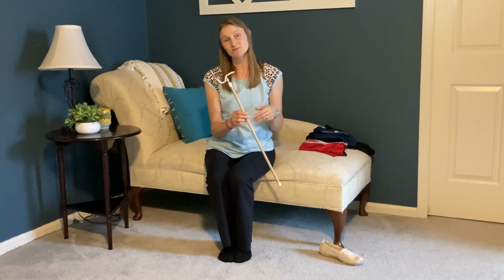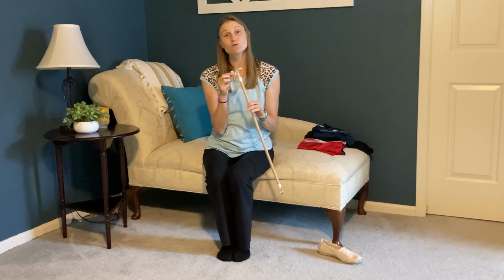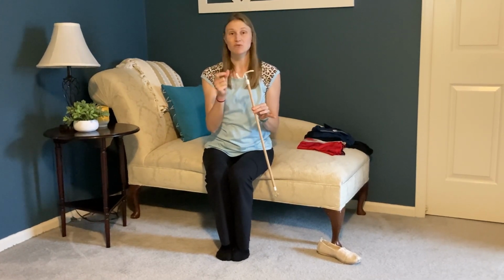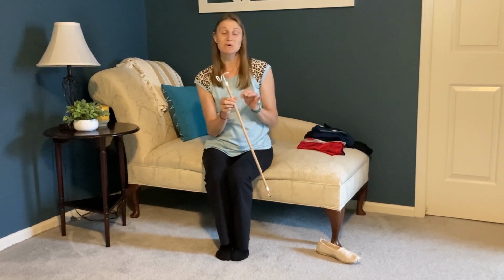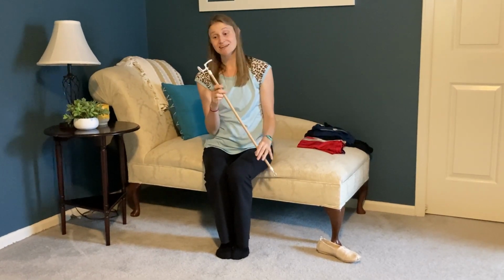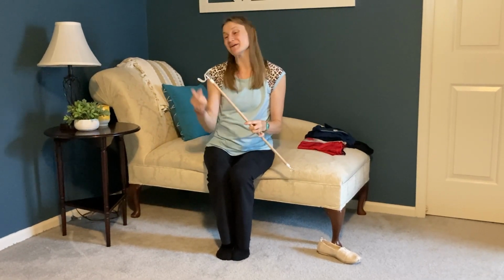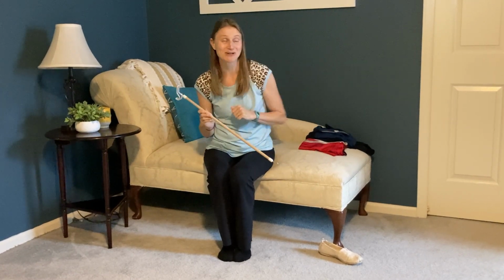On the other end of the dressing stick, you have two larger hooks. One faces upward, the other faces across and down. These are also coated in a kind of smooth, soft plastic to keep them from rubbing on your skin and causing a skin tear as you use them. Most commonly, people use their dressing stick as a glorified back scratcher. It does work for that, not meant for it, but given that soft tip on the edge, it is a safe way to scratch your back without scratching your skin.